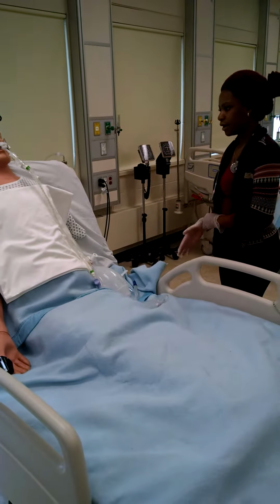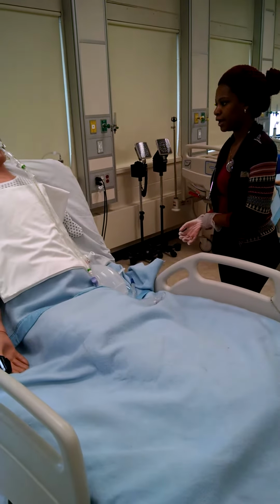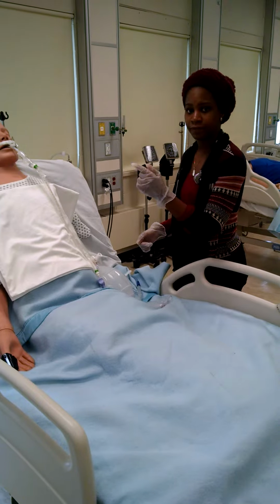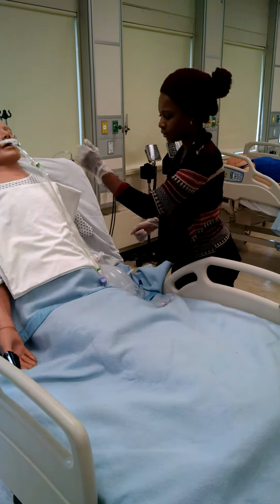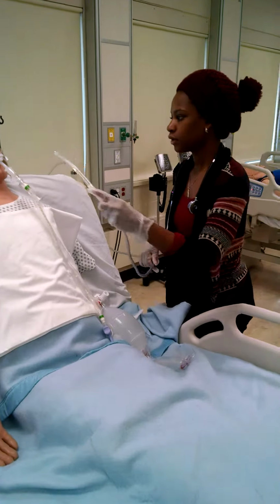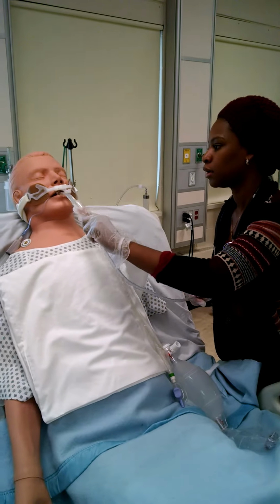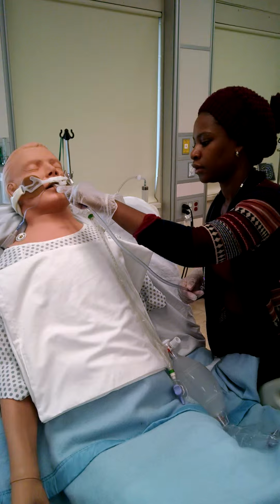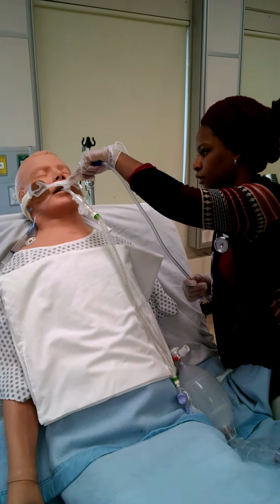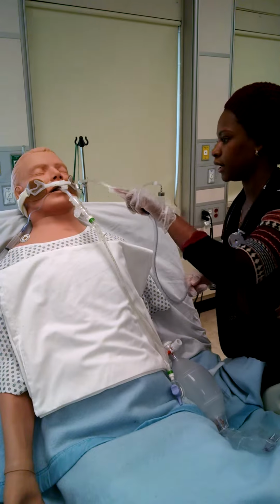Okay, and at that point I will go ahead and suction each side of his mouth, on each side of the tube, the ET tube. Okay, great.